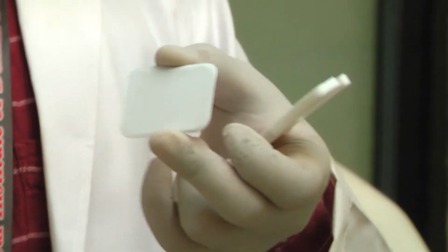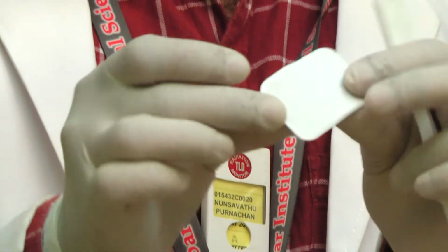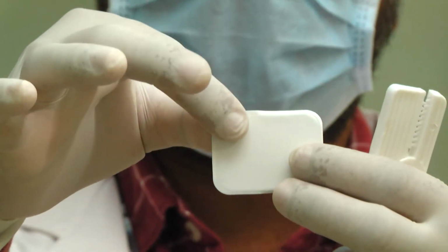So always the white surface, or non-exposed white surface, has to be towards the X-ray tube. And while placing the film in the oral cavity, always remember there is a raised dot or knob on the corner of the film. This raised dot or knob should always face the incisal or the occlusal surfaces.